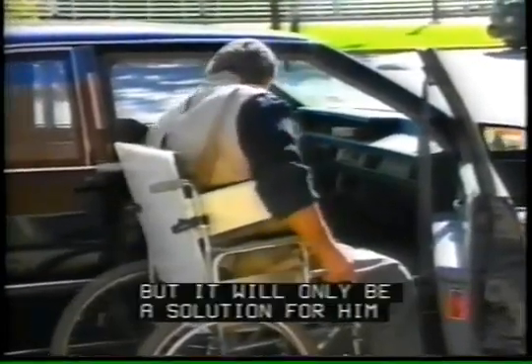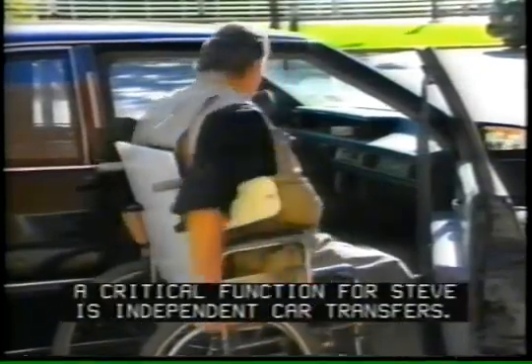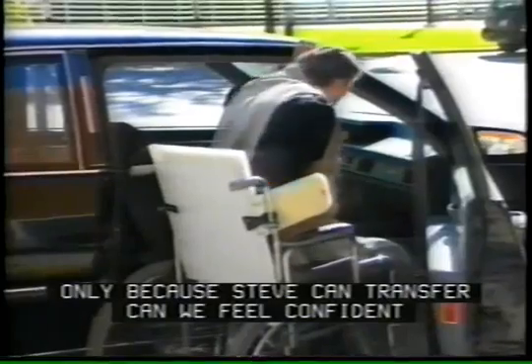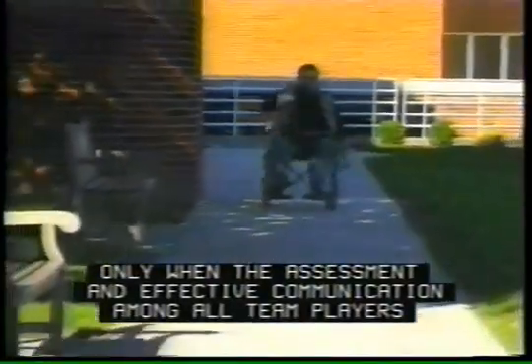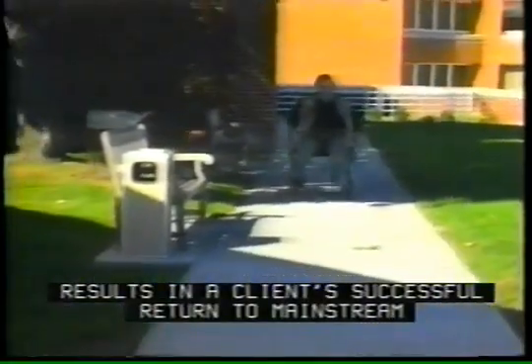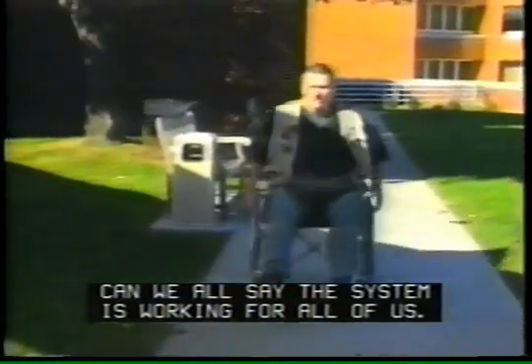The suggested supports may improve pressure distribution and correct Steve's deformity, but it will only be a solution for him if it allows him to function independently. A critical function for Steve is independent car transfers. Only because Steve can transfer can we feel confident that the options offered really can be solutions. Only when the assessment and effective communication among all team players results in a client's successful return to mainstream can we all say the system is working for all of us.